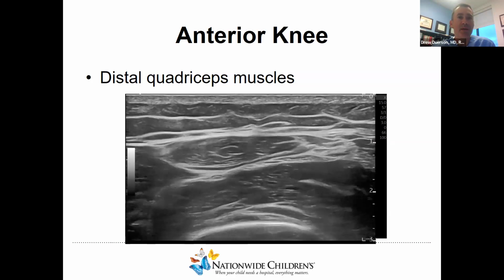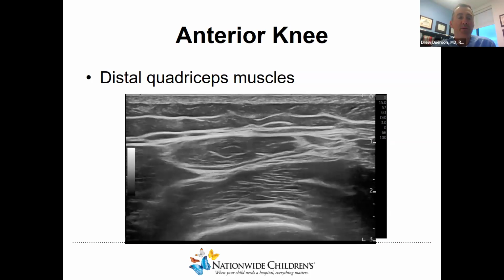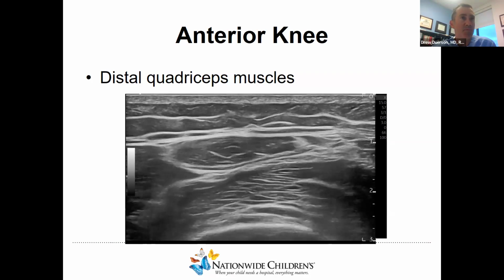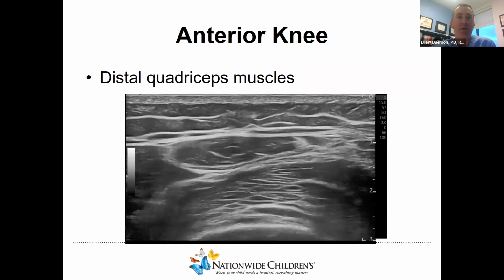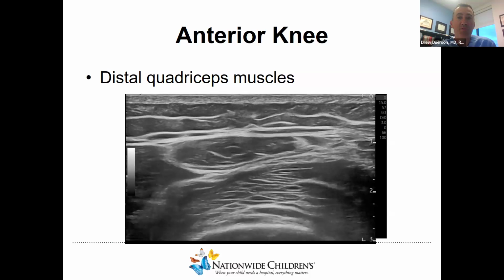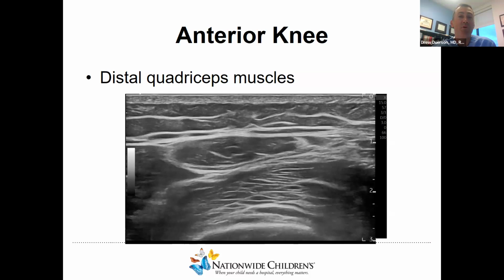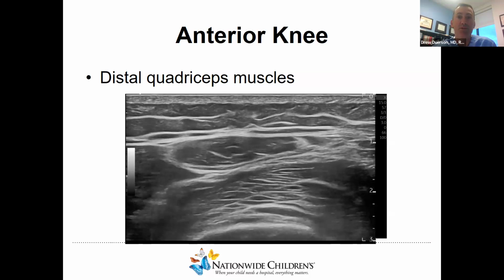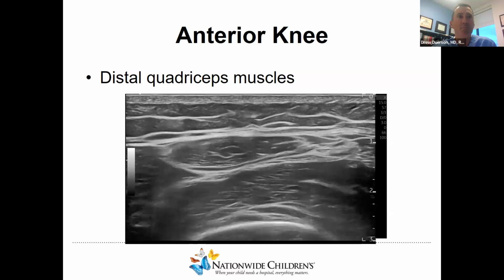Also, maybe not so much in this case, but I'm going to be looking for fat atrophy, which will make the muscle look more echogenic, which has always been interesting to me, because muscle by itself is hypoechoic, and when you look at fat, it's hypoechoic. But if you put the two together, it gives us a more hyperechoic image, and that's because now you've replaced that muscle tissue with fat, and we have more tissue interfaces with differences in impedance, so we get more reflections, making the atrophied muscle more echogenic.